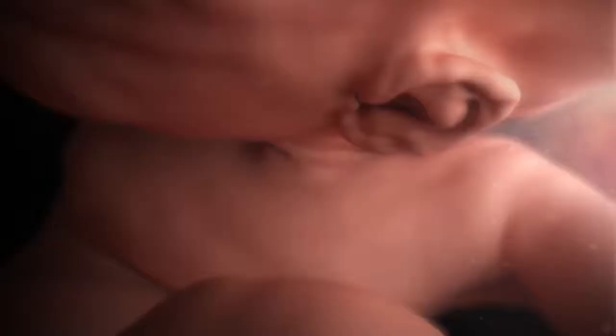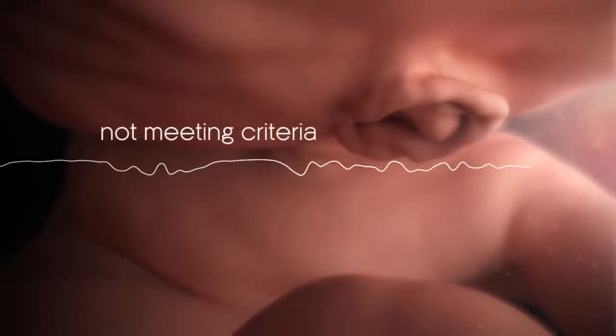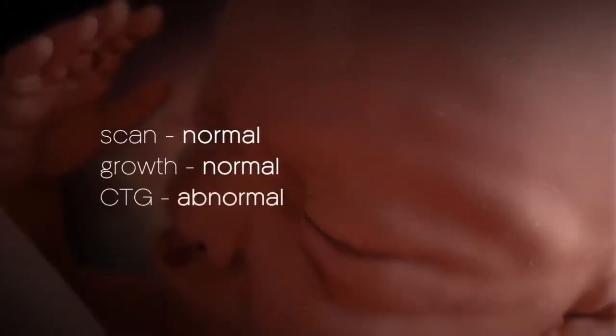We had a case, the patient was 35 weeks pregnant, and the baby had a really flat CTG that was not meeting the criteria. Based on the CTG, we decided to deliver that baby, and the baby came out alive, but with really poor gases. The scan was normal, growth was normal, but CTG was abnormal. So CTG in that case saved that baby.